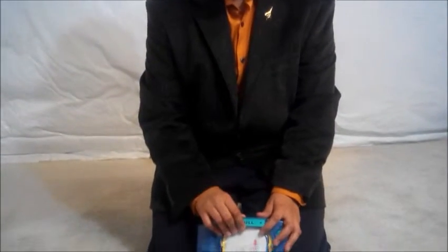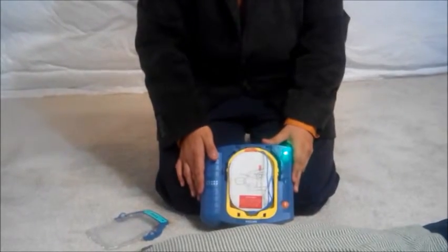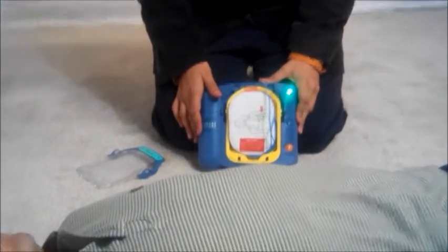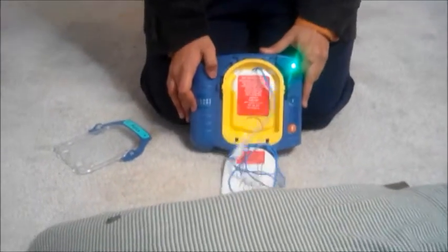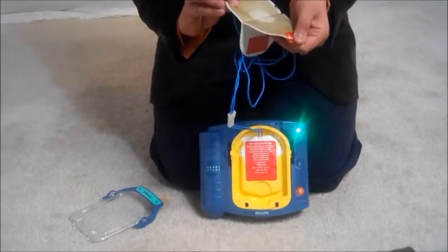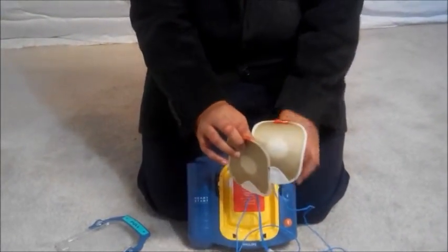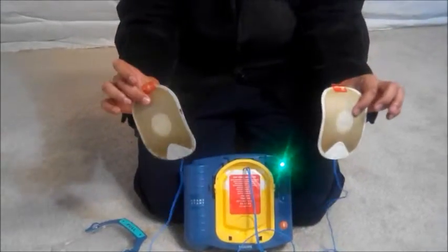So suppose this is a real-life situation in which a patient is going through a sudden cardiac arrest. First, we open the defibrillator by unlatching this latch so that we can get the pads and put them on the patient. Begin by removing all clothing from the patient's chest. Cut clothing if needed. So suppose I have the clothing removed from the patient and I unpeel the pads. Look carefully at the pictures on the white adhesive pads. Peel one pad from the yellow plastic liner.